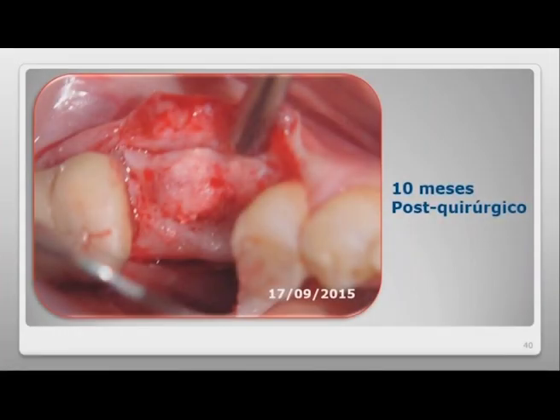And more than an X-ray at this time, 10 months after the extraction and insertion of the material, you can see the amount of new bone in the extraction site. I think this clinical image gives us an idea of the results that we can observe when using this material. I insist, with a correct diagnosis and knowing exactly what we are going to do and what we can expect from the material. This photo is the opening just before insertion.